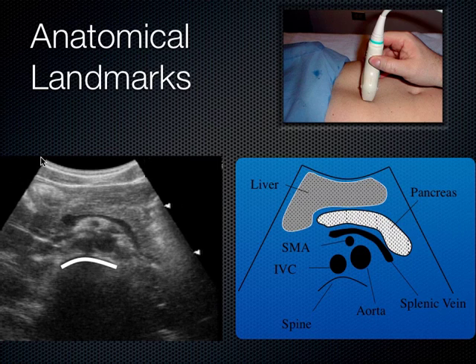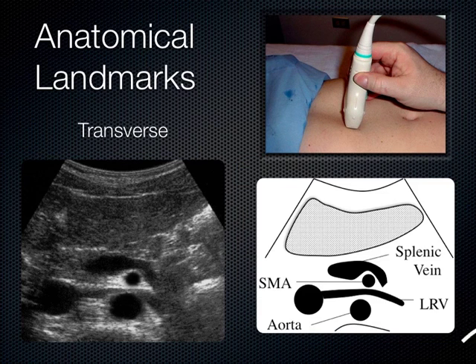Now, based on this probe's footprint, which probe do you think we're using? C60, exactly right. We don't have those upstairs. We have the P21s, and they do okay, but ideally, when you're talking about the aorta, the C60 makes the best images.